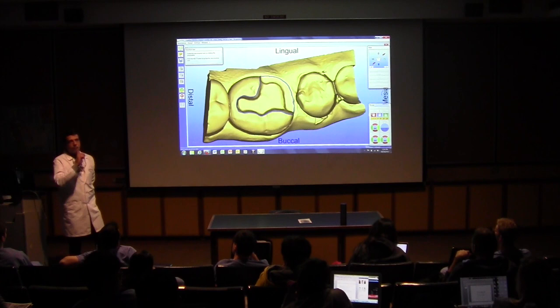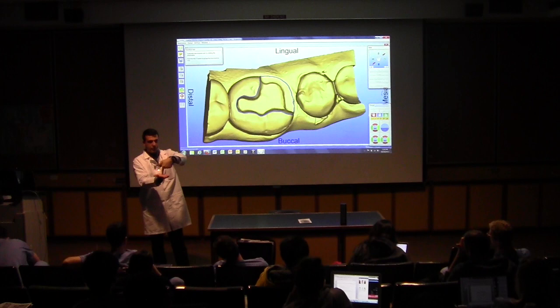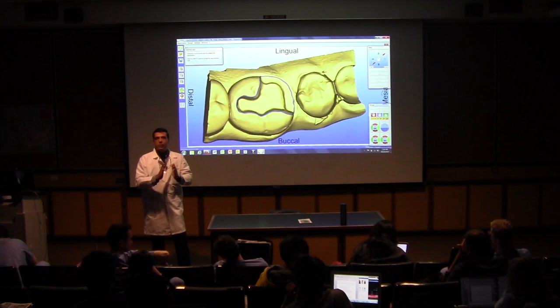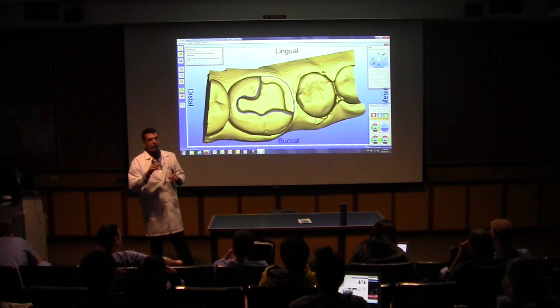Now, the diamond point itself will give you some sort of divergence, some angulation. And as Dr. Porto mentioned, the diamond point is parallel to the long axis of the tooth. Immediately, you're supposed to have 6 to 8 degrees. But there is no way to measure them, even using the software. As long as you can take an occlusal view and see all the internal angles, you're good. The only thing is, I noticed last lab, some students are doing way too much divergence.